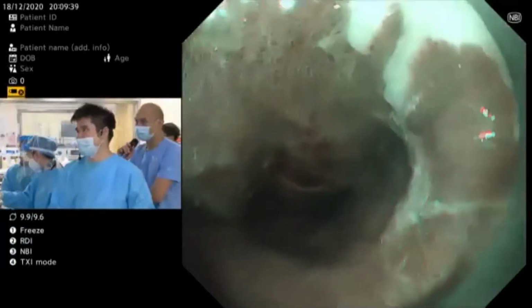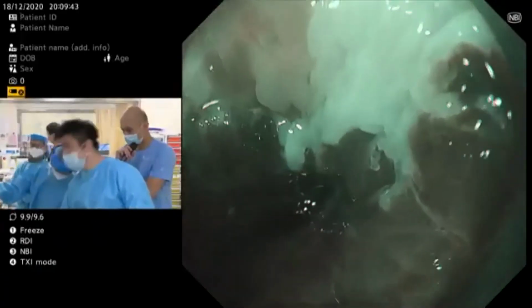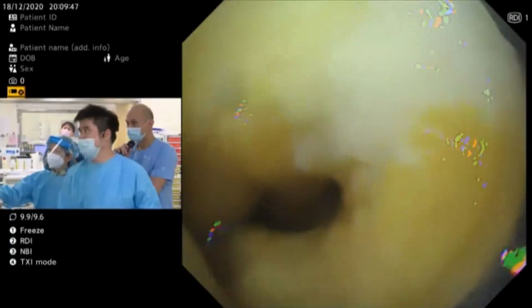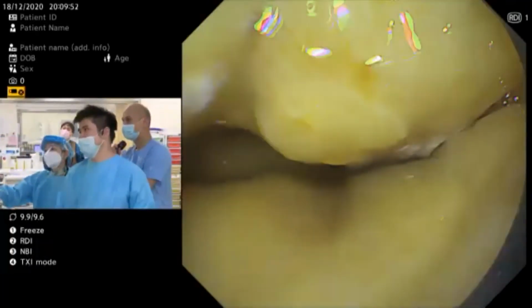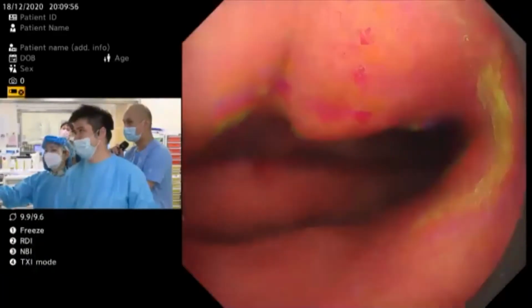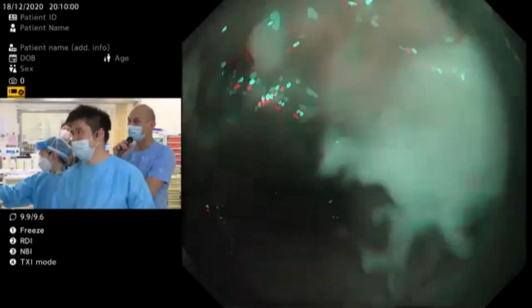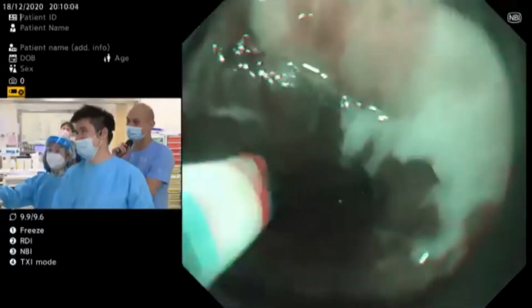So you can show us now the RDI just quickly. Sorry, let me try. Yeah. So the RDI looks like this. It's a yellow color. If you see blood, it's like a jaundiced patient, so not scary. But right now it's not useful. So later on, hopefully we won't see a lot of bleeding, just enough to show the device.